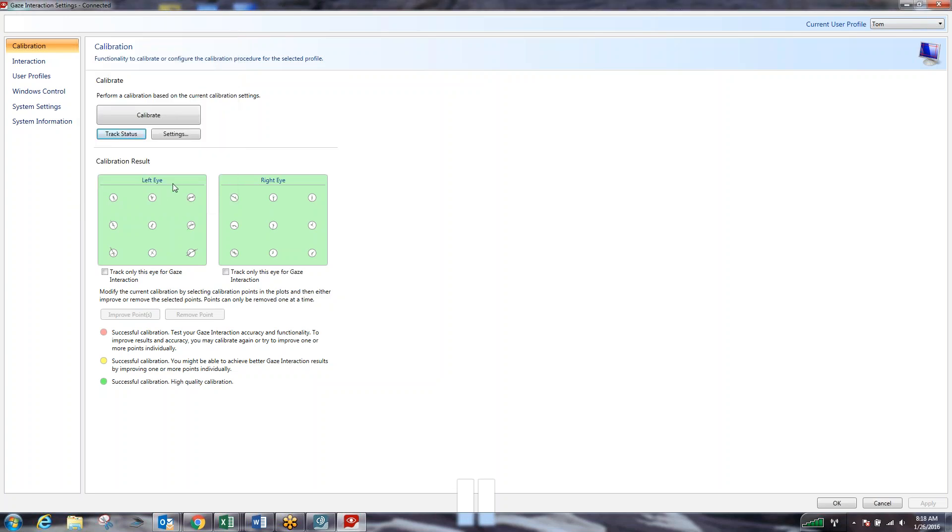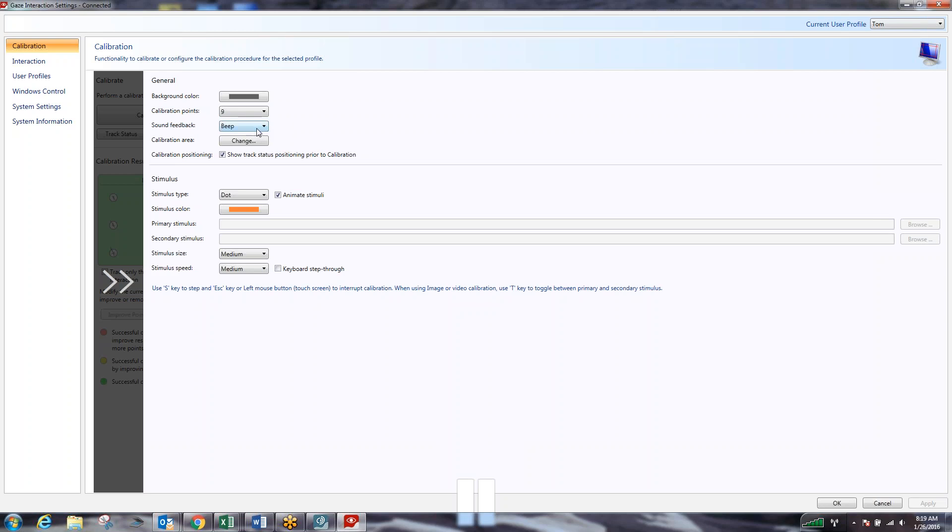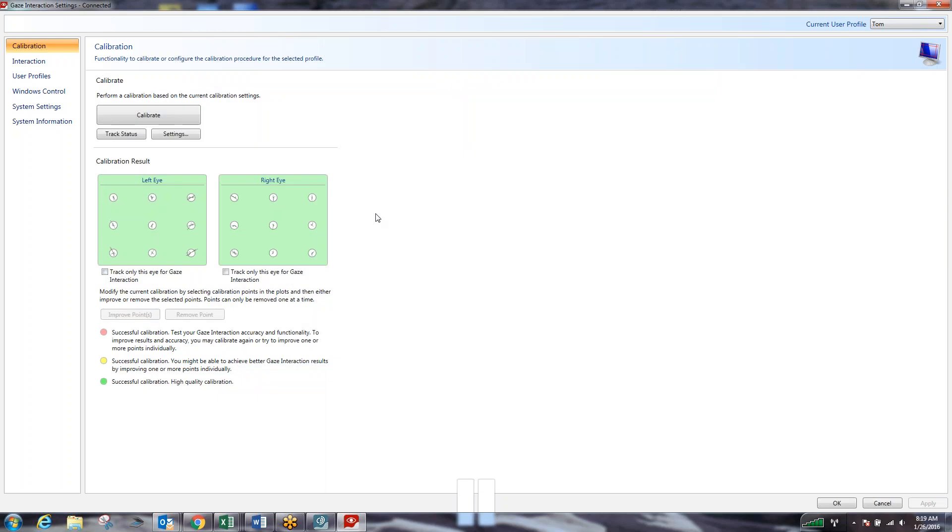And now what we're going to do is look at our settings. Currently we're set up with nine calibration points. That will give us the highest quality calibration as it's the most number of points on the screen that we can calibrate. But if we have someone who's struggling or is younger and we have attention issues, just because following a dot around the screen nine times can be less intriguing, we do have the option to change it to five locations or two locations. You can change the calibration area, the sound feedback, the stimulus type, the color of the stimulus. You can actually put in pictures or little videos if you're using something that would be more engaging. In most cases we don't need to do that. We're just going to stick with nine calibration points and continue on.